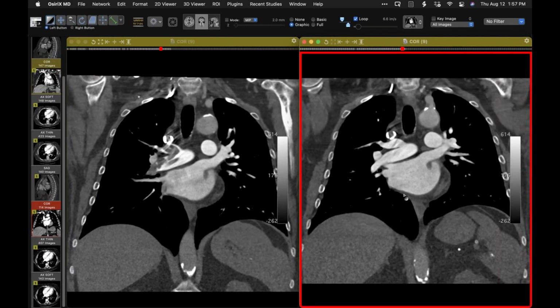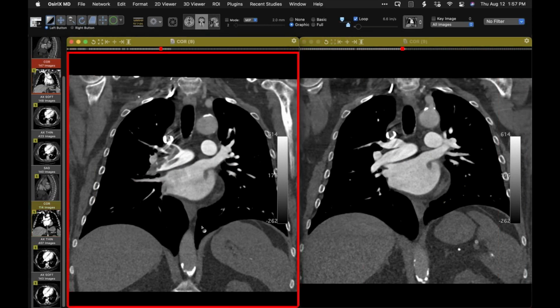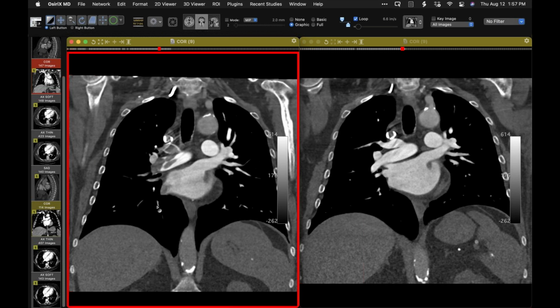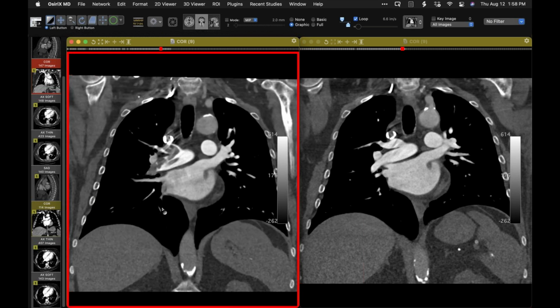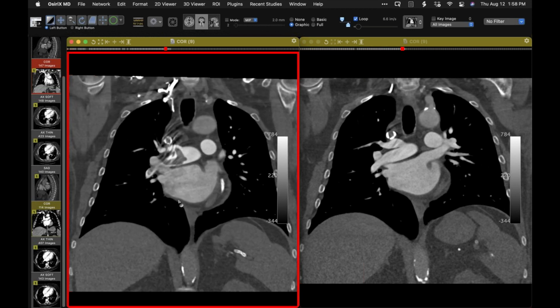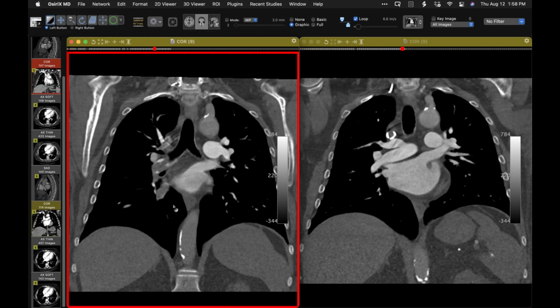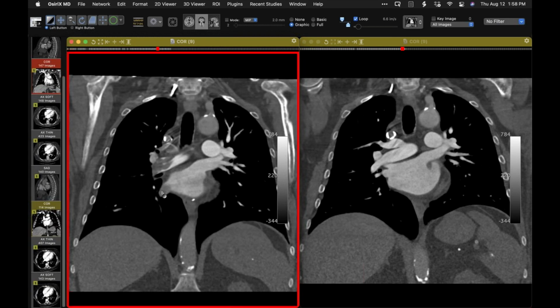But completely gone, which is so nice. So as a follow-up, reassuring. Yeah. But no, I remember when you showed it at first, it did have some ugly features to it that at least gave you pause. Yeah, for sure. On the day when I saw that, that gave me pause. And there's streak artifact coming into the inferior vein too. Yeah, so we have a relatively slow flow, and yeah. That's a pretty intense one.